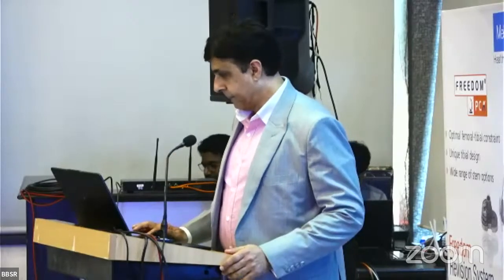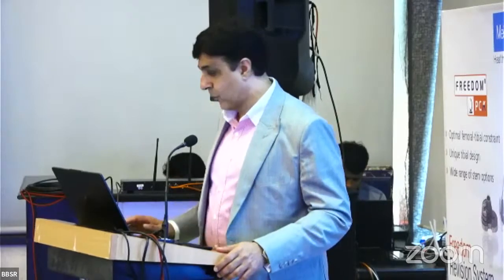And she's 85, so you have to handle it. Just moving on from there. The problem in this case is the osteolytic patella with fracture, the axial patella that we have through. You have a dislocated extensor mechanism lying in the lateral gutter, valgus deformity, and you also have compromised tibial and femoral bone stock, because it's not only the extensor apparatus, your tibia and femur are also compromised in this case.